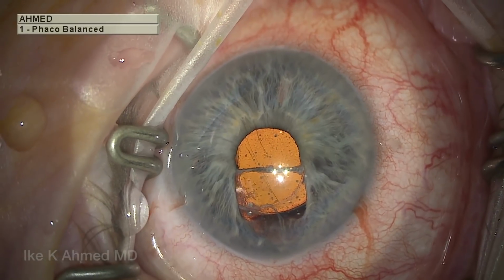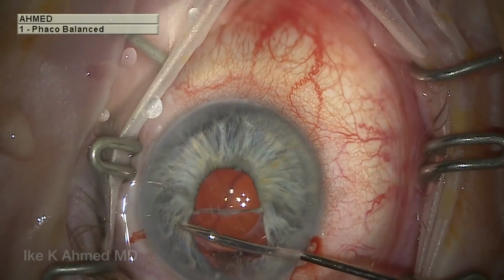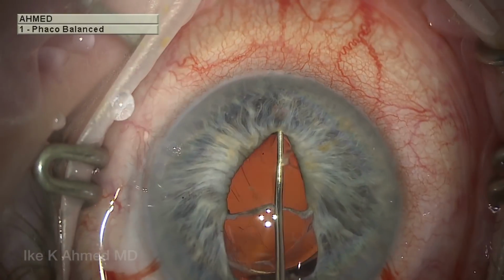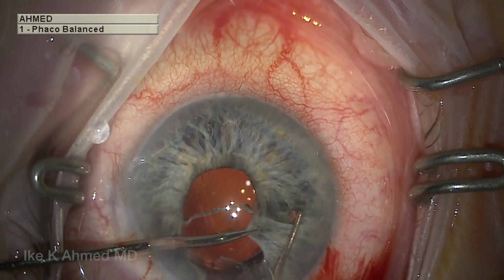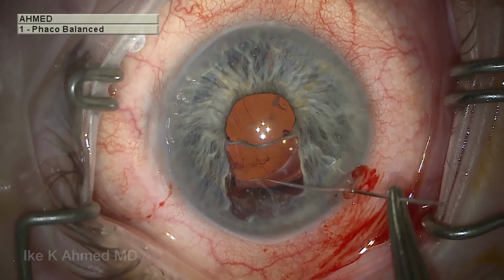As a result of complicated phakic emulsification, this patient is left with a large temporal iris defect and significant photophobia and glare. The IOL was in the bag, and although an iris prosthesis can be considered, I felt a direct closure of this iris defect can be accomplished here. Notice the distensibility and the elasticity of the iris, and this allows us direct closure.